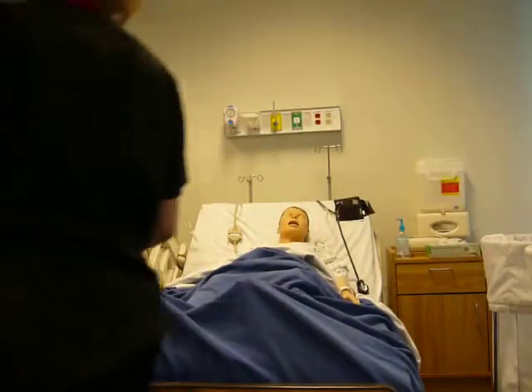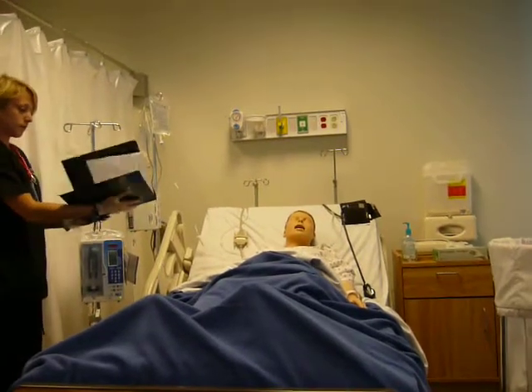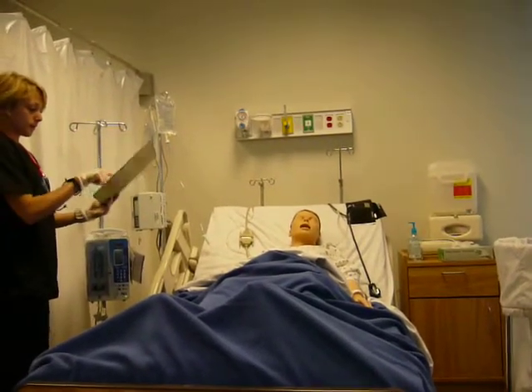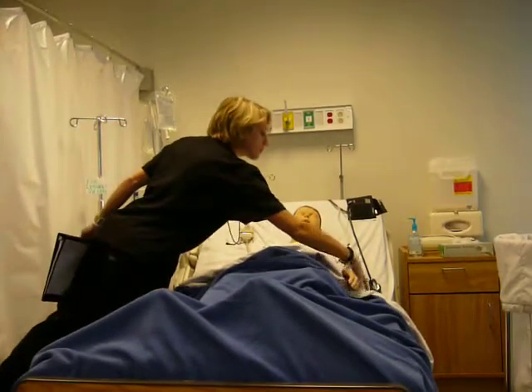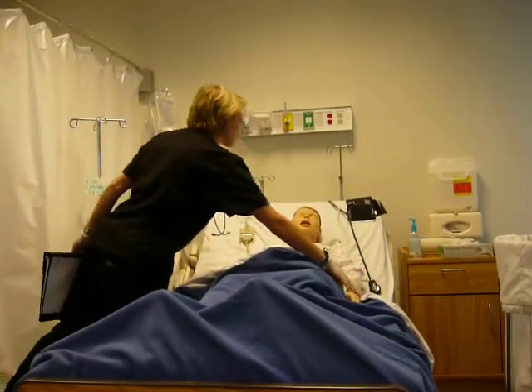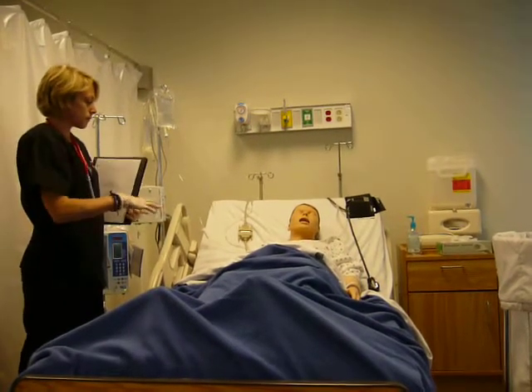You would also check the rate and the med with your MAR and with the patient identification to ensure that the anesthesiologist correctly set the pump and gave the medication. You would also want to obtain verification of this information from a second nurse.